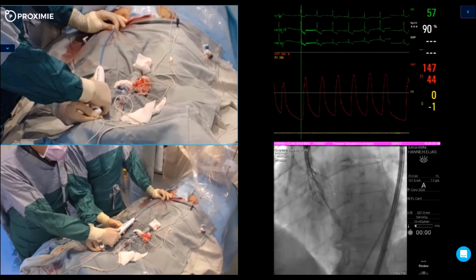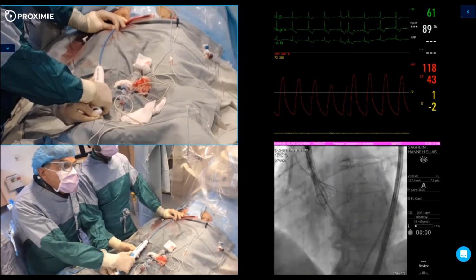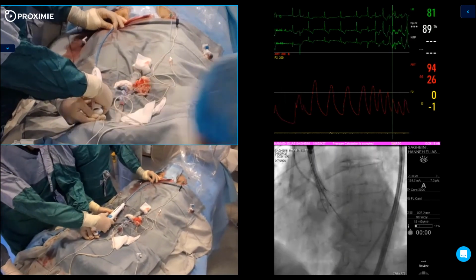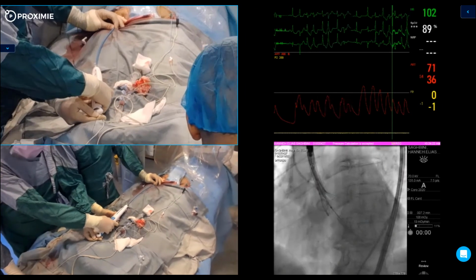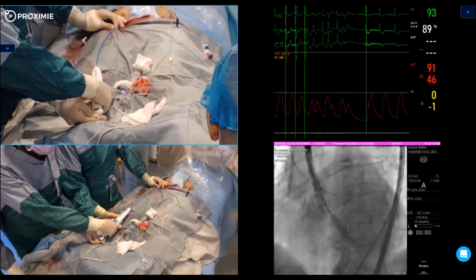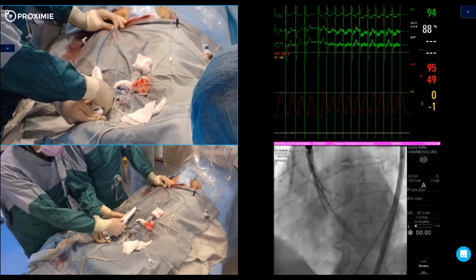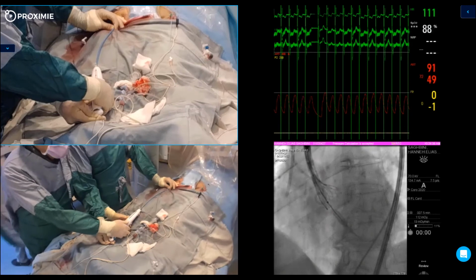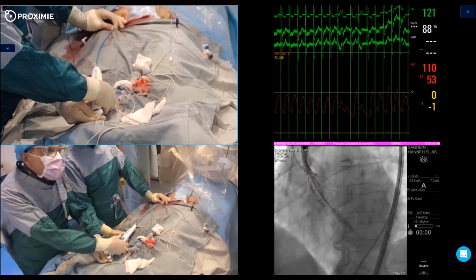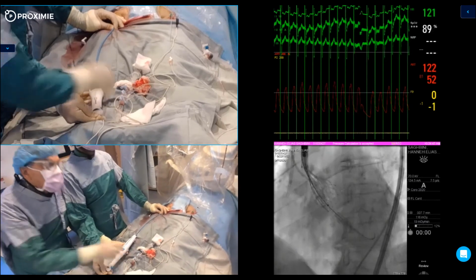So Dr. Hazal is resheathing here. Keep going, keep going. And stop.